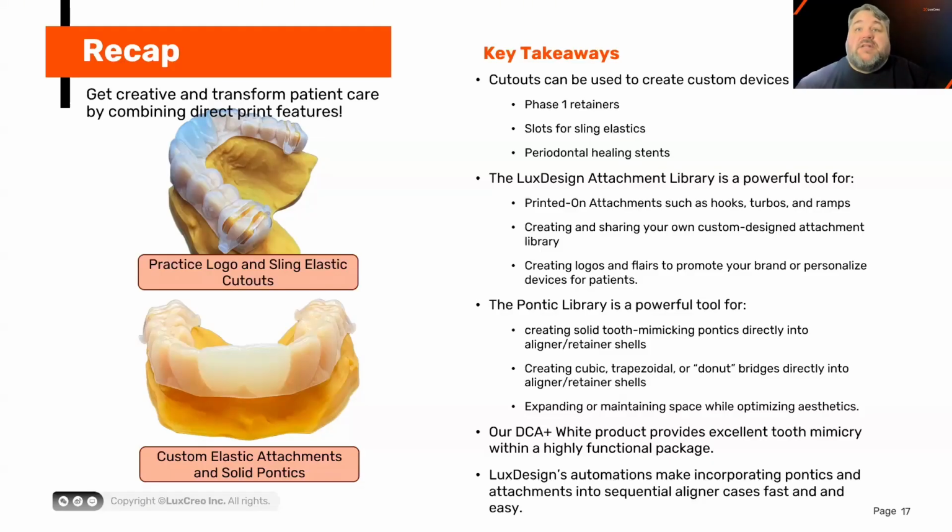Like Raj said, that personalization can absolutely help with compliance. Being able to use that pontic tool for the solid tooth mimicking, printing them directly into the shells. That's what we're trying to do with these technologies, is innovate and provide you with the tools to be able to make really fantastic devices for your patients.